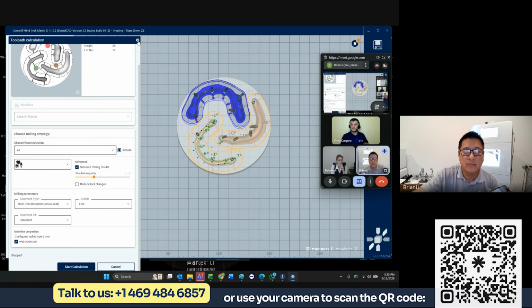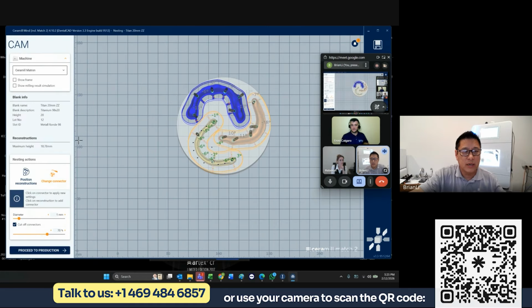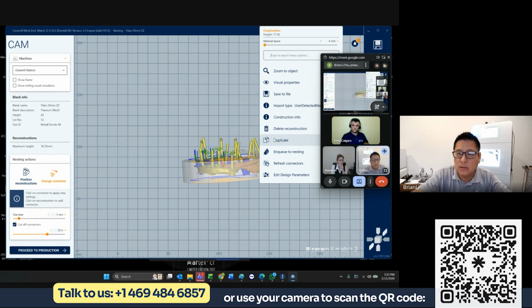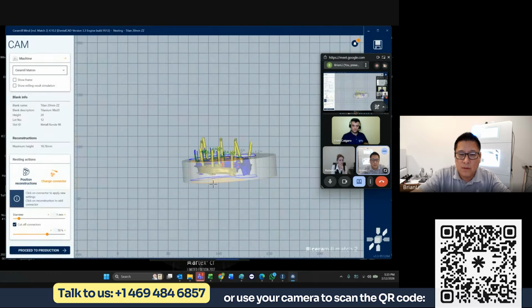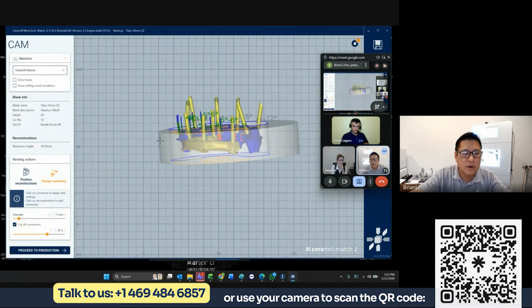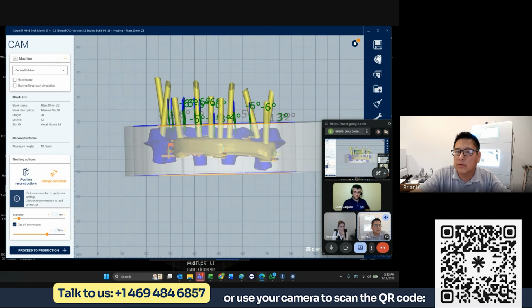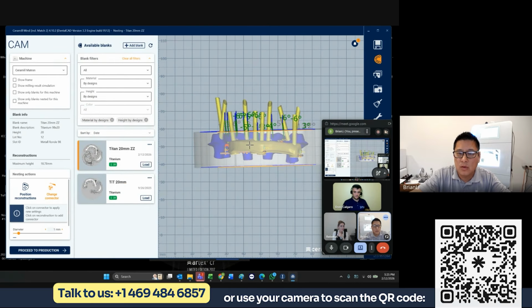Here's the other thing I skipped over. But when you guys see these, let's delete this one. You can see here that, let's get rid of this. Restoration.